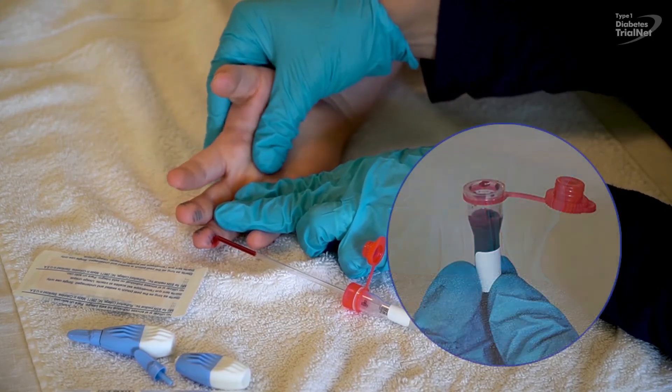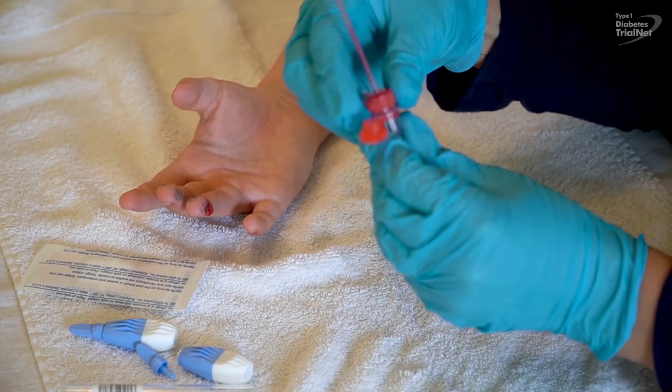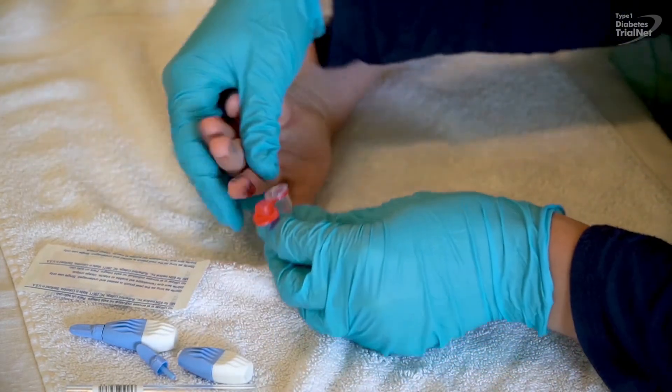Please fill at least half the tube if possible, or as much as you can. If you have trouble getting enough blood to flow through the straw, try removing it and holding the tube directly against the puncture site.